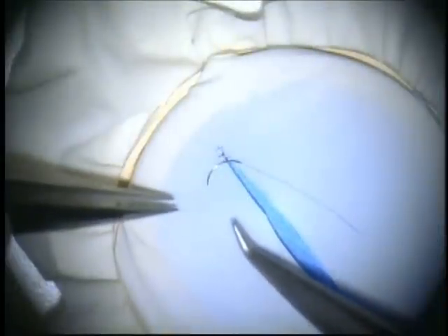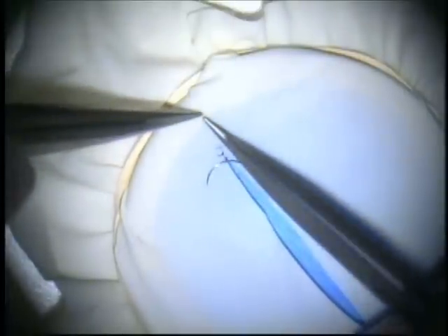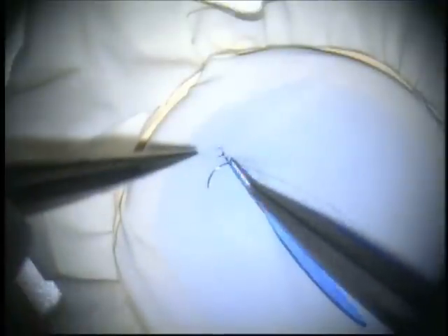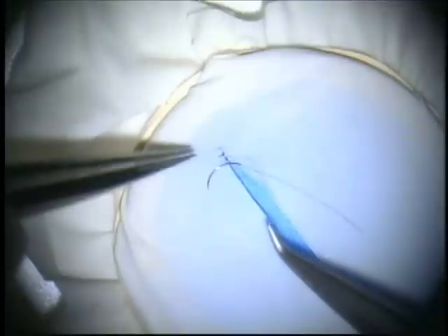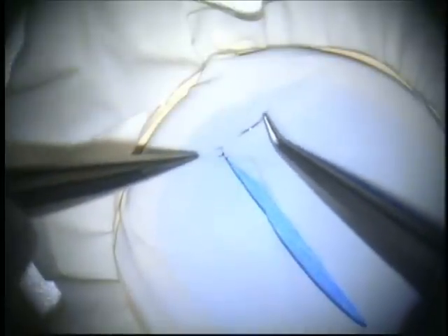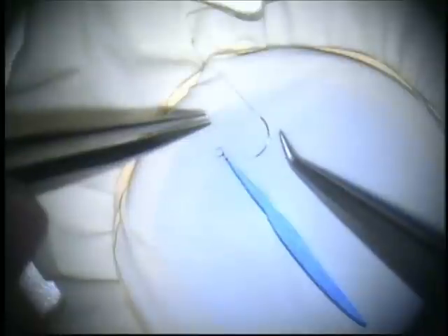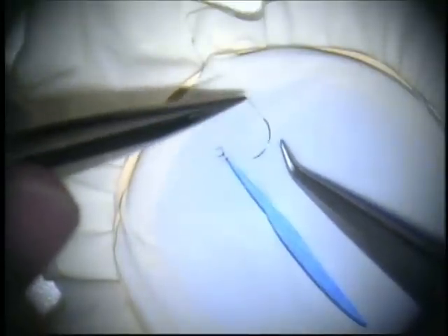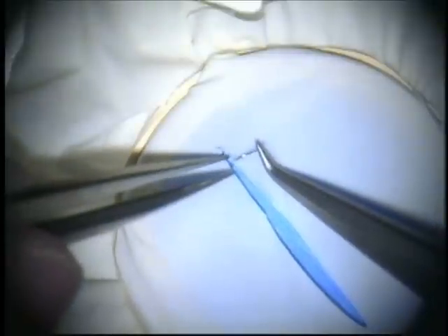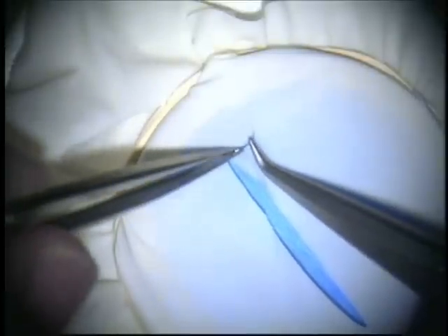Now let's do some microsuturing. Here we are under the microscope. Notice that the cut in the glove latex runs from away from me on the left to towards me on the right — this is the easiest position to start suturing since it's the most natural one. The first step is picking up the needle. For the experienced microsurgeon the needle can be grasped rather easily, but when you're first starting it's a very frustrating chore. It's helpful to stabilize it with the suture end and then grasp the needle about two-thirds of the way from the end. You don't want the needle too close to the tip of the jaws because it might easily jump out.